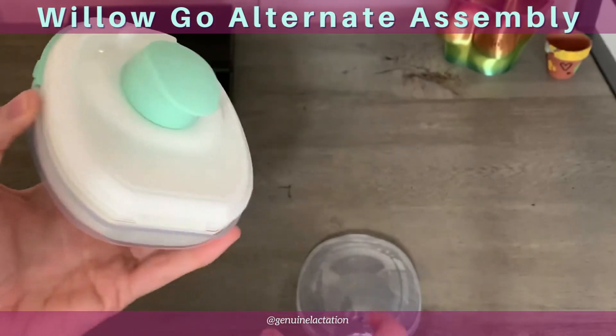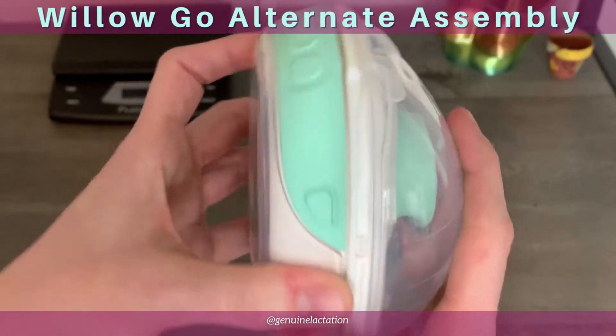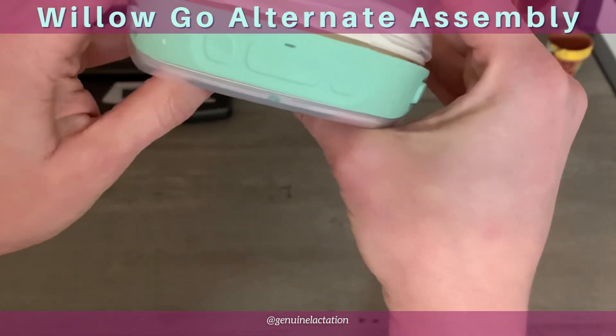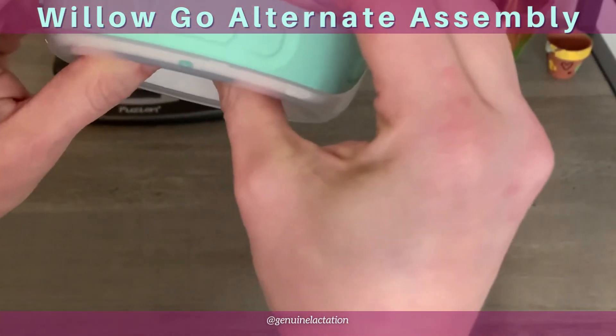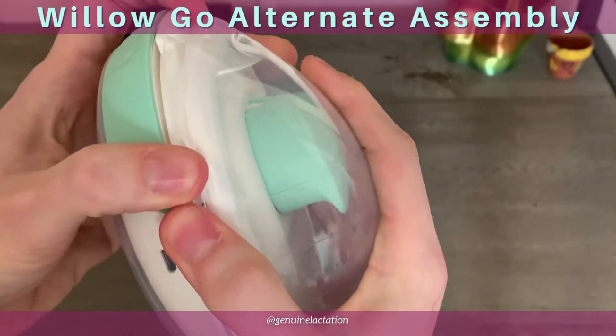Double check that, then take your container and press it straight down so that both sides are coming on at the same time. I did not get that on there quite right, so pull that apart.